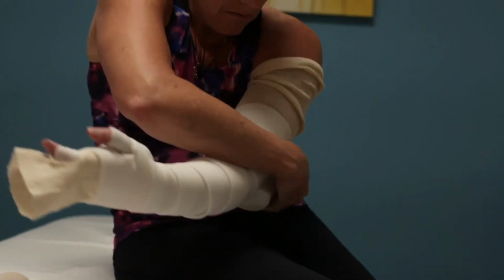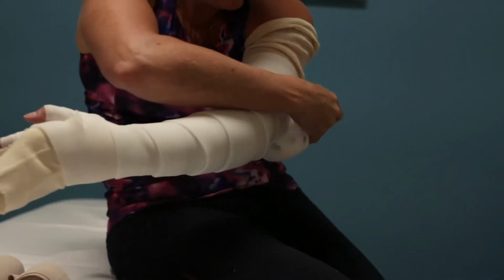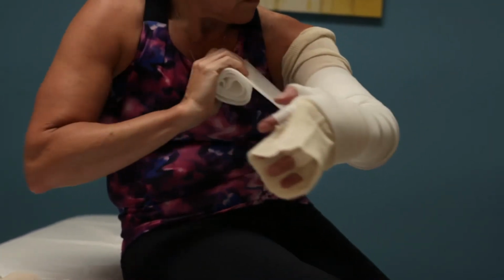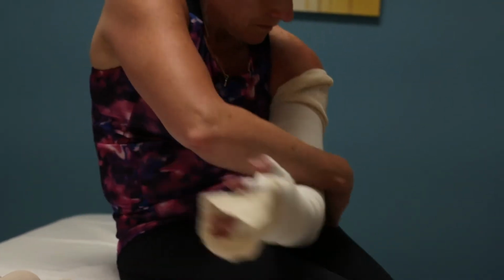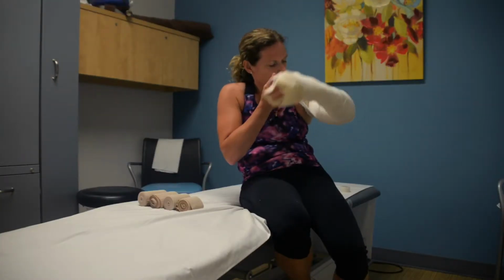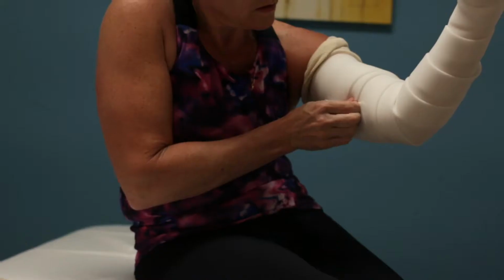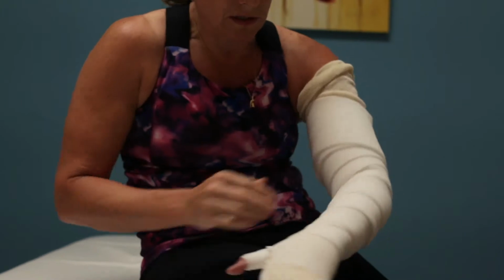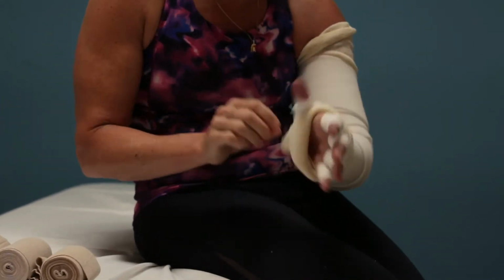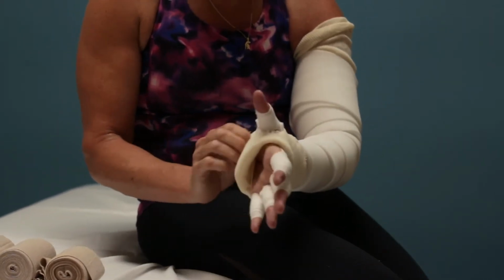To the armpit. Not really much pull on the rolled foam. You're just kind of getting it on. All the way up into the armpit. At that point in time, I'm just going to tuck that rolled foam right into itself. And then your stockinette is pulled back. So now you're really ready to start the short stretch bandage.